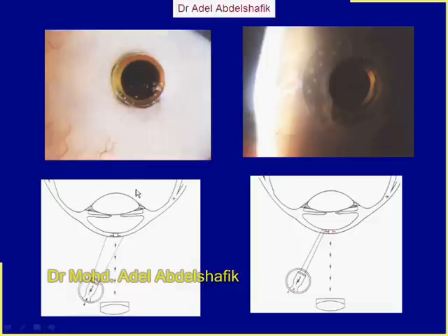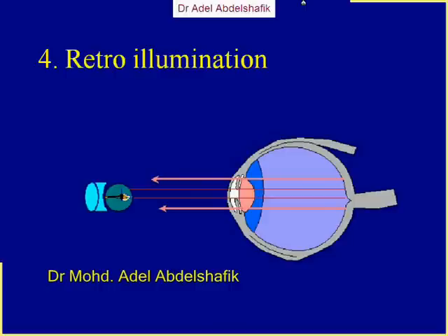Here, the illumination and the microscope are focused on the same location. But here, we unlocked the light and pushed the light to the side here. So light scattered in the cornea, then you could see this part. So instead of focusing the light on the same location, put the illumination aside and keep examining the same area. You will see more things.